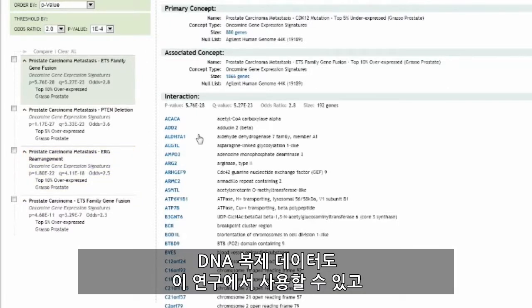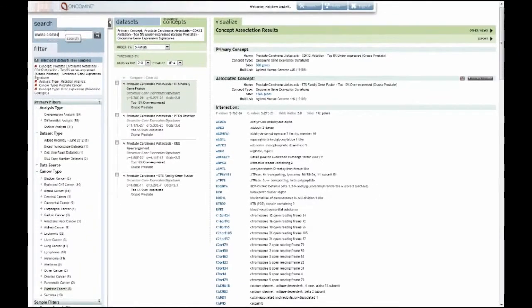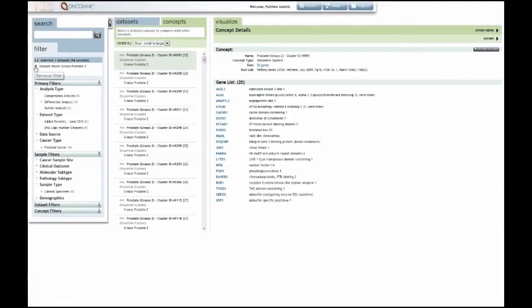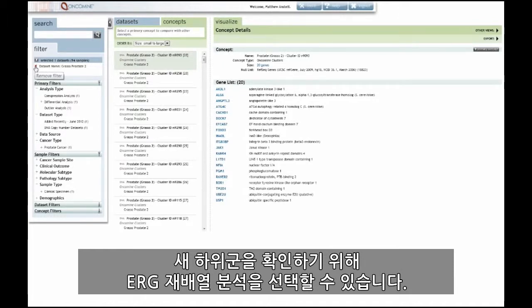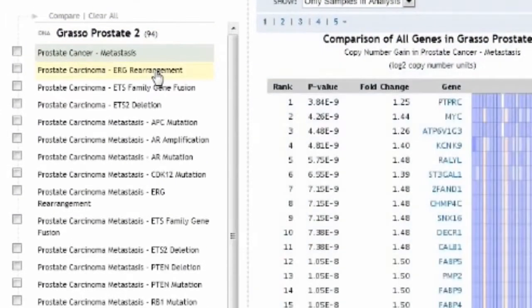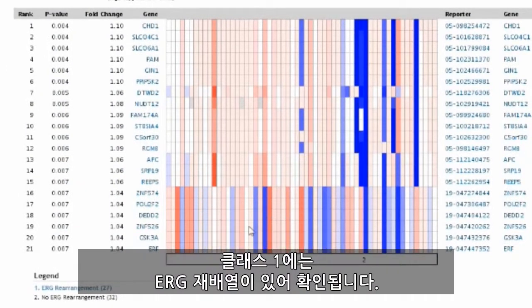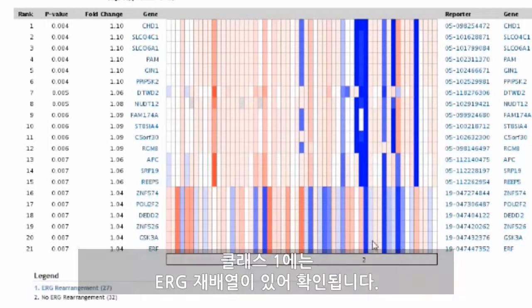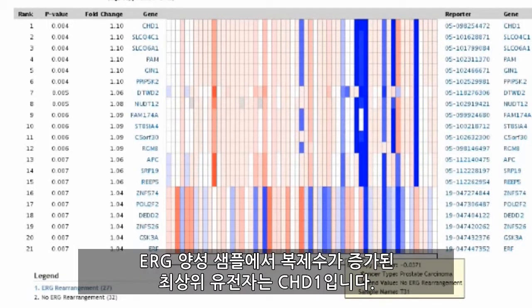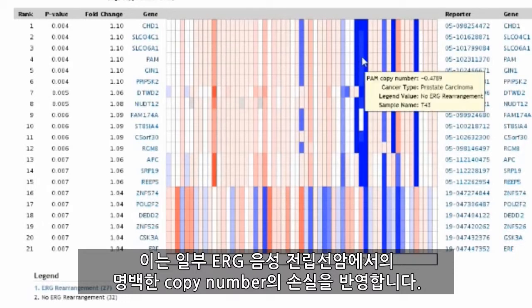DNA copy data is also available from this study and can be explored in the Grasso Prostate 2 study. To identify new subsets, we can select the ERG rearrangement analysis. Copy number gain and loss are identified within ERG rearrangements in class 1 relative to no ERG rearrangements in class 2. The top-ranked gene for copy gain in ERG-positive samples is CHD1, reflecting the apparent copy number loss in some ERG-negative prostate cancers.